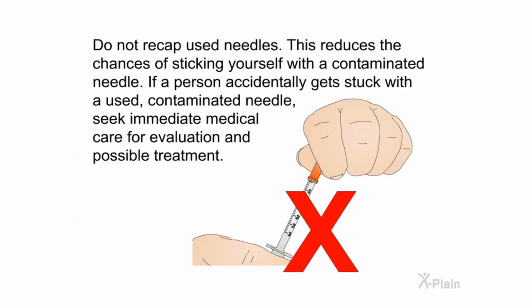Do not recap used needles. This reduces the chances of sticking yourself with a contaminated needle. If a person accidentally gets stuck with a used, contaminated needle, seek immediate medical care for evaluation and possible treatment.